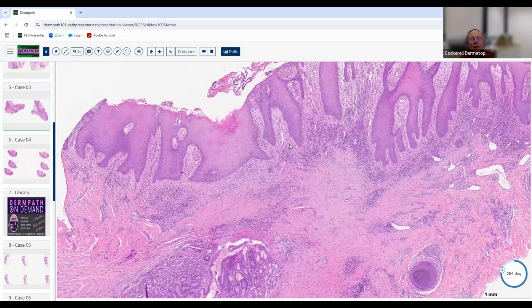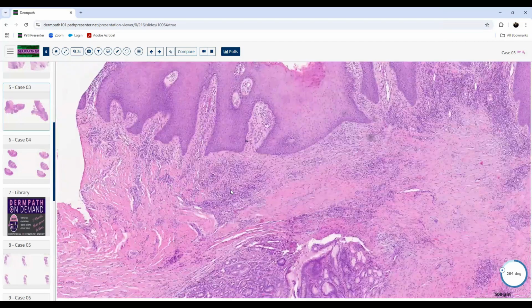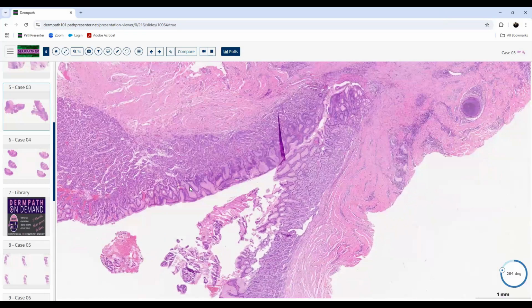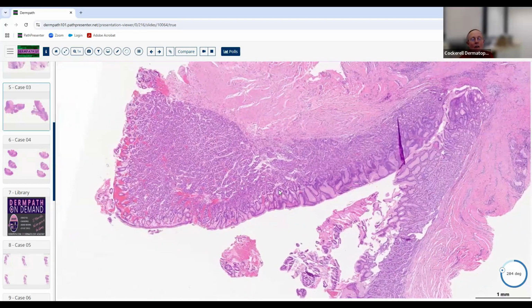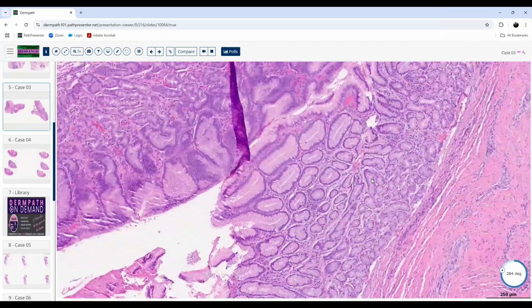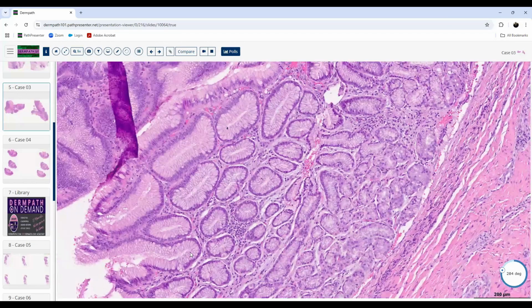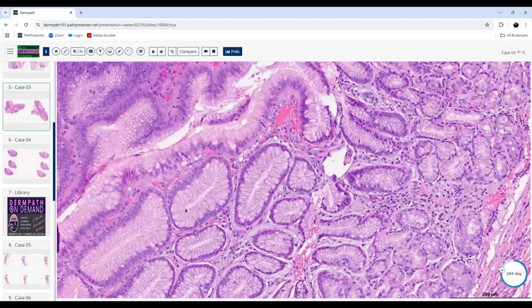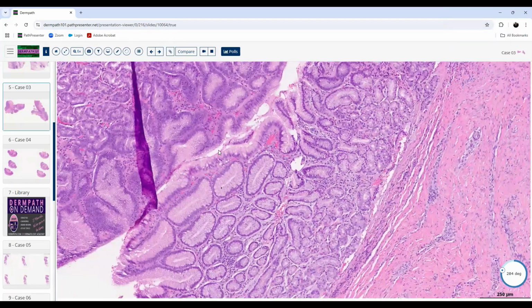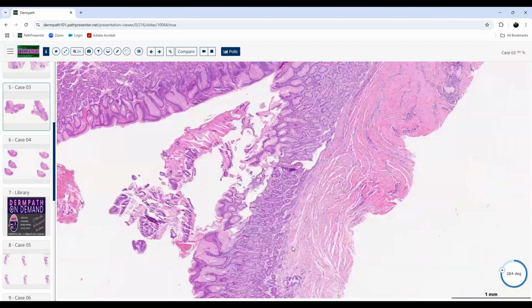Yeah. There's some inflammation. And then we thought, yeah, that area to the left was GI mucosa. Like with the villi? I think it's like simple columnar, and then there's some glandular tissue there. Good. And then underneath there's some muscle, all that pink stuff, deeper.